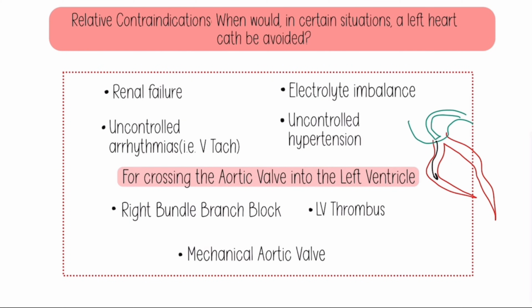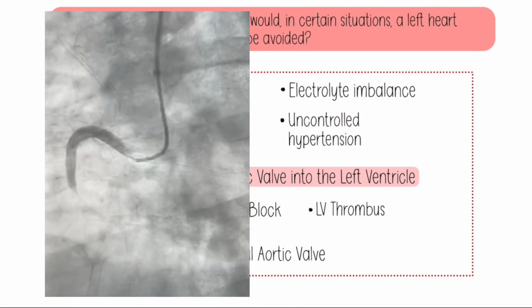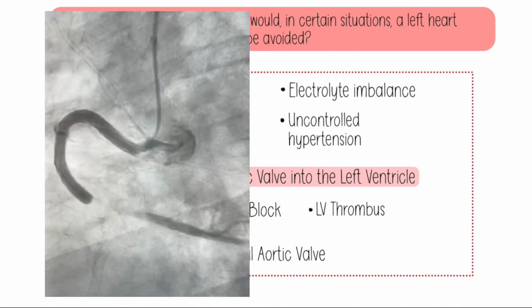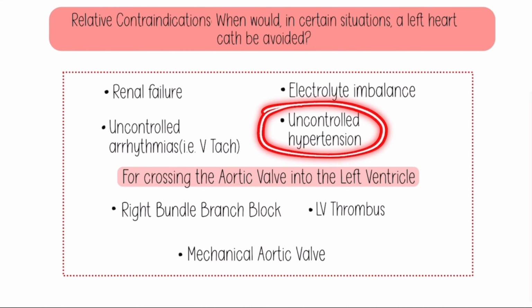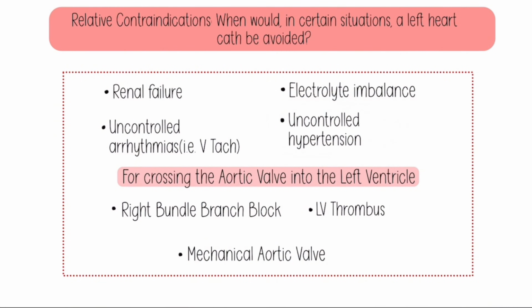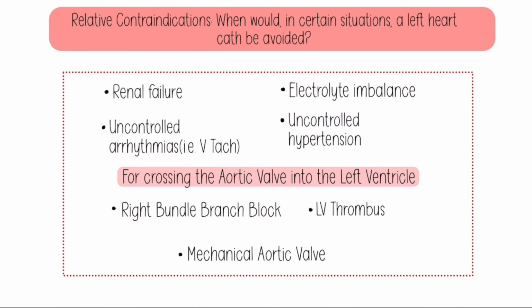If you have hypertension, your arteries can be predisposed to what we call dissection. Under intense pressure or from a mechanical aspect, for instance catheter engagement going up against the vessel, and me injecting contrast against it, I want your arteries to be happy and compliant with what I am doing in and around them. Hypertension causes unnecessary stress in that area where I'm going to be causing stress trying to do the procedure, or a physician will. So we really want to control this first, either with medication, etc. Sometimes sedation will also naturally decrease the blood pressure. We want to control this first before proceeding with the procedure.